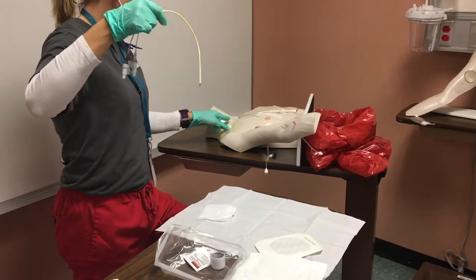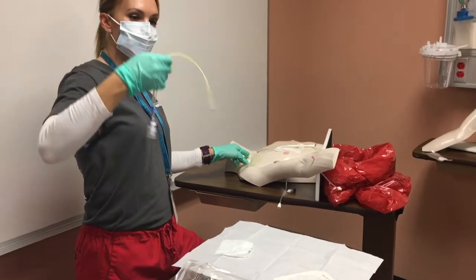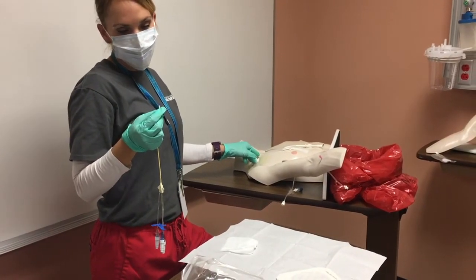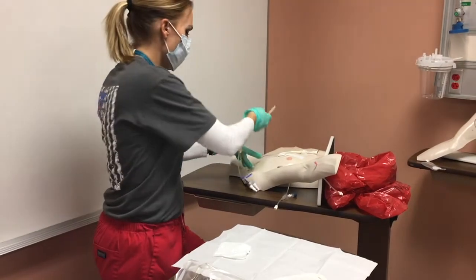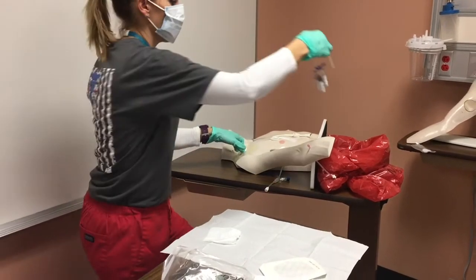Then you're going to hold a good amount of pressure on the site. You want to look at the tip of the catheter — what you're looking for is to make sure it's intact and that there aren't any blood clots on it. You pull it out, assess it, and then put it into the bag.